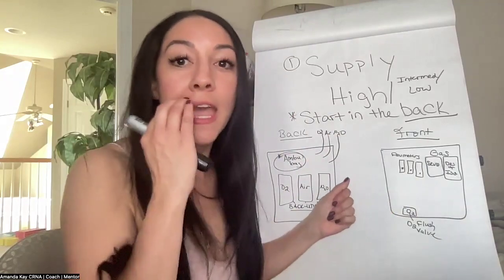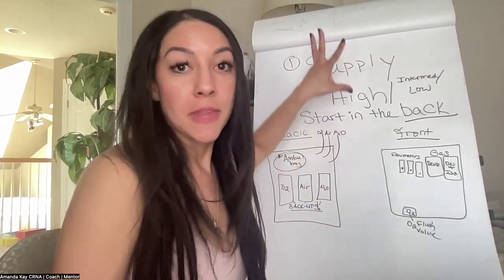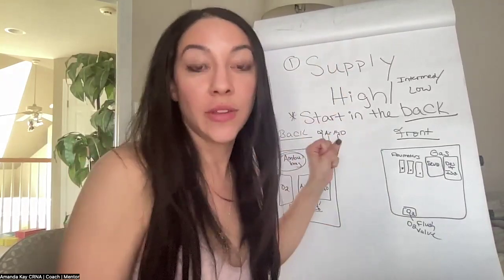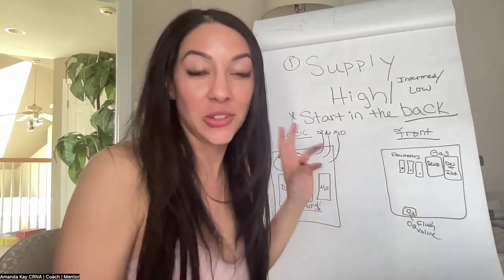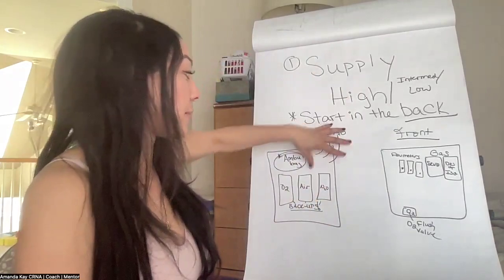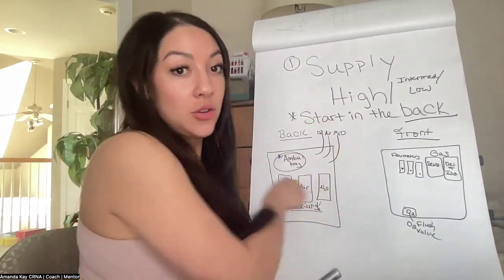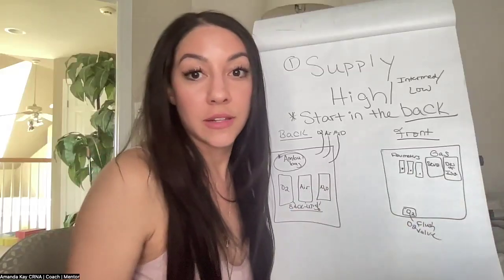If you have oxygen failure from your pipeline, it's going to screech so loud. You will never unhear that sound again. You will definitely know if there's no oxygen coming from your pipeline. And if there's nothing from the pipeline, it's going to go into your backup tank. So if your pipeline is running low, you can usually crack open your other tanks and use that as well.